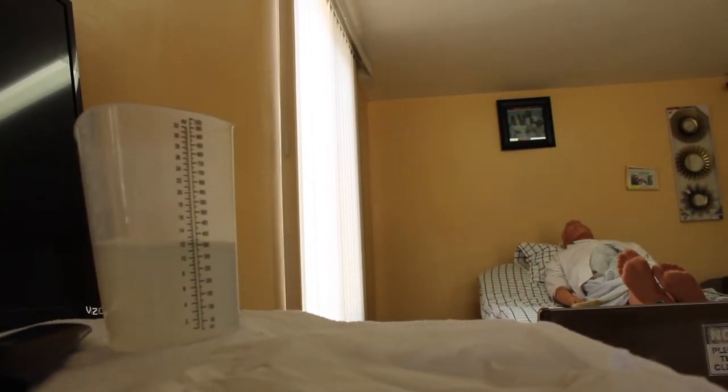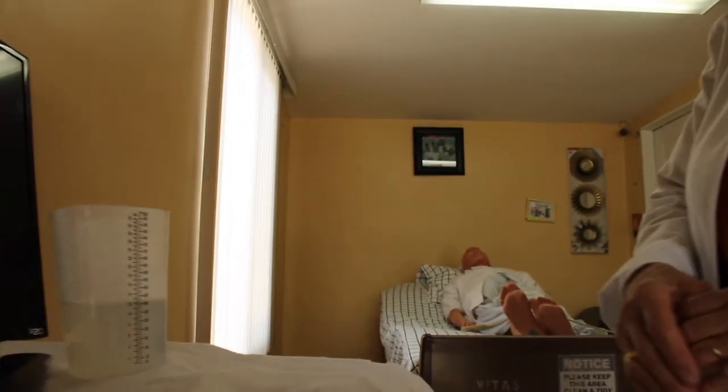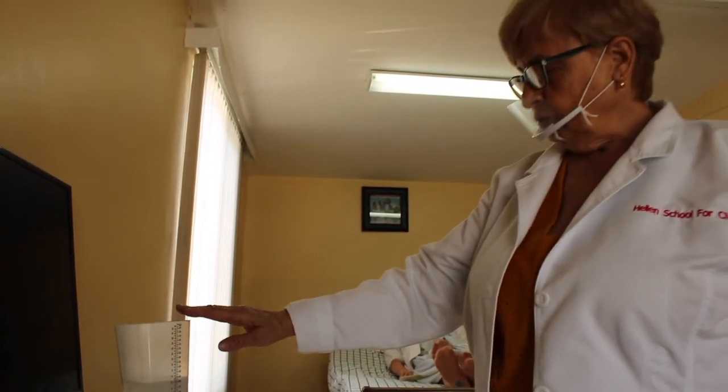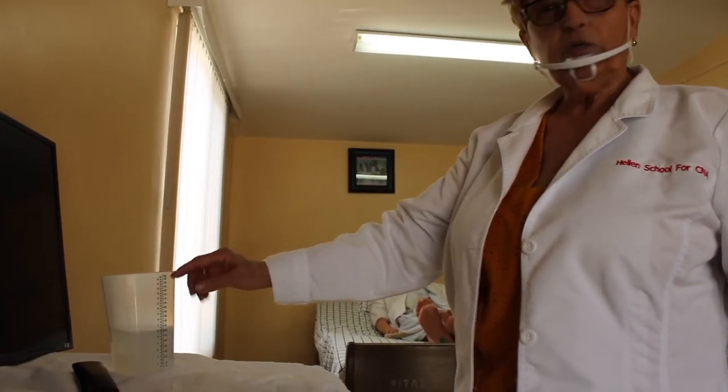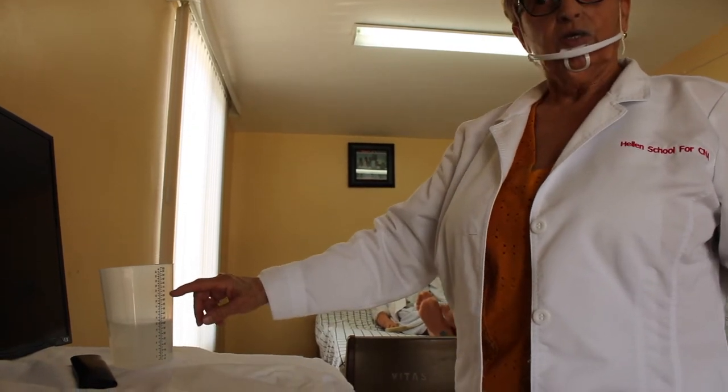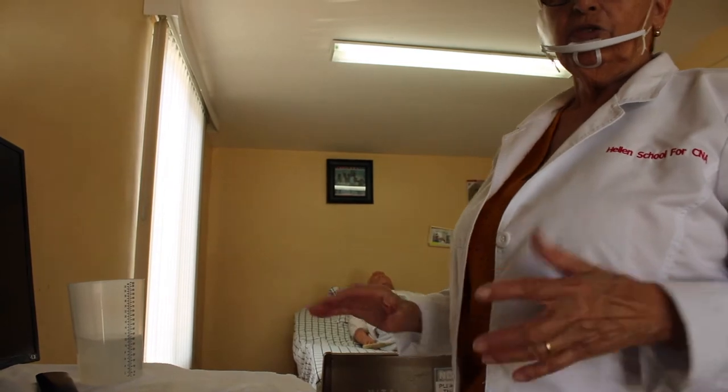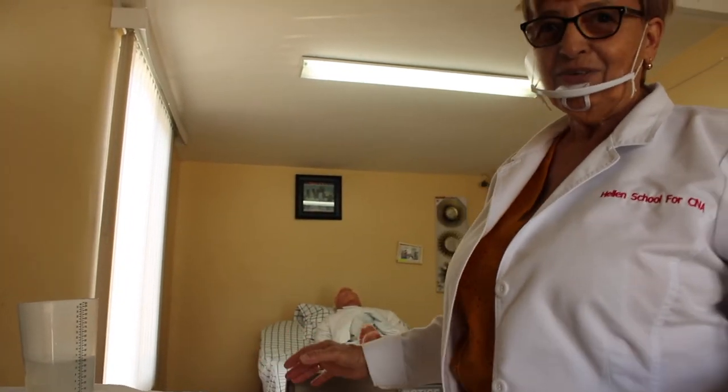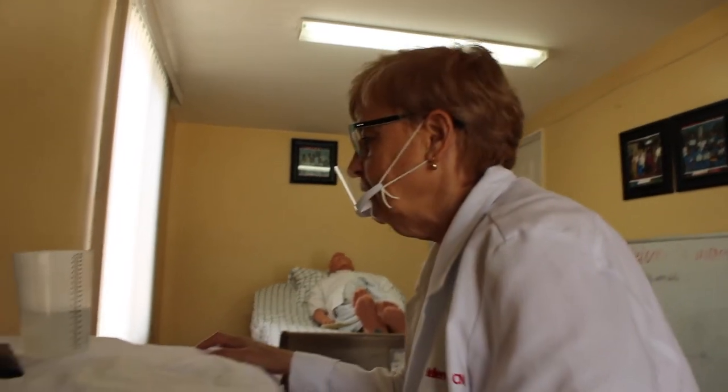The critical part for measuring the output is to have the measured container or the graduated cylinder. Graduated means you can see the numbers on the flat surface, and you read at the eye level. That means you have to bend the knee. It's on a flat surface, now I'm going to bend the knee.